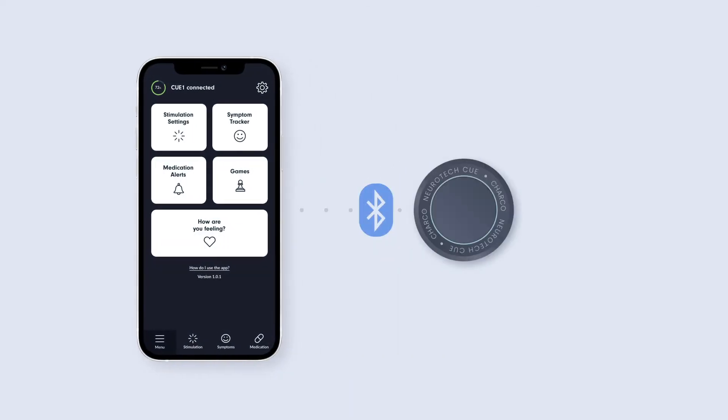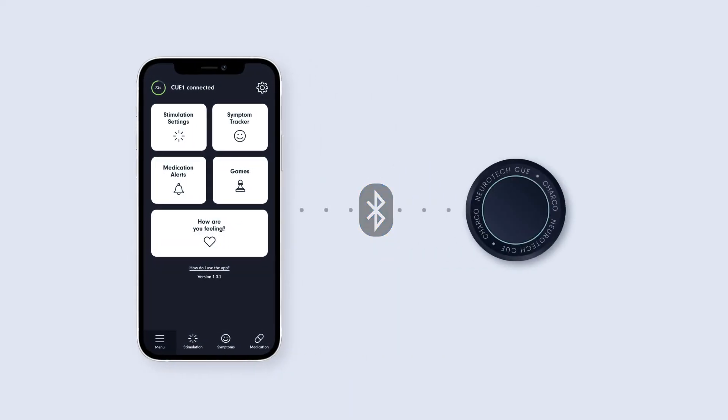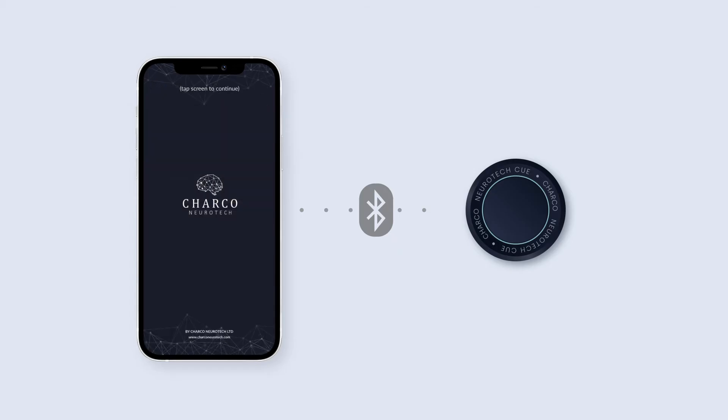The app will disconnect from your Q1 automatically after a few minutes of inactivity, or if you quit the app.